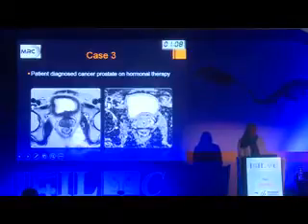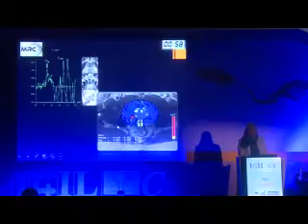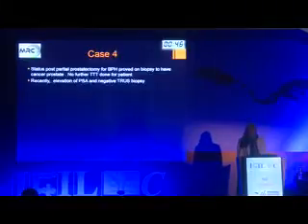Another case, a patient with hormonal therapy. If we rely only on this morphological image, it is very difficult to distinguish the mass from the post-therapy changes. And so comes the role of the dynamic contrast enhanced study, where there is a small lesion located at the right peripheral gland, and it also shows an elevated choline peak, denoting that this patient still has a small residual tumor.